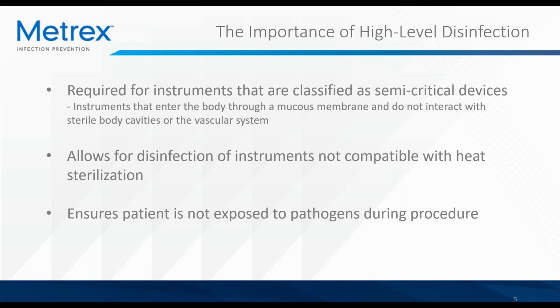Because high-level disinfection kills nearly all microbial life, the patient is likely not exposed to pathogens when using these devices. And that's the goal for everyone. Patient safety is top priority, and high-level disinfection has an important role to play in keeping the patient safe.